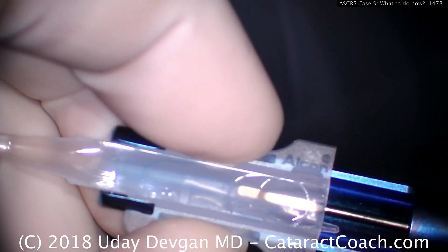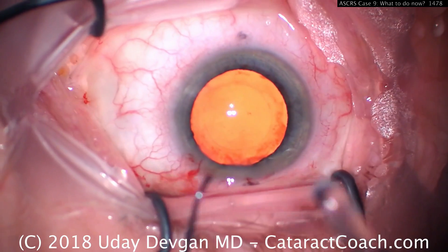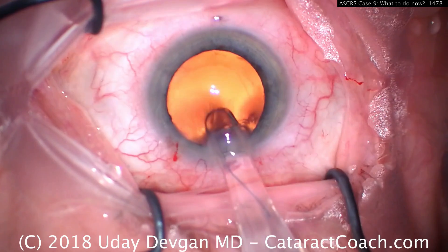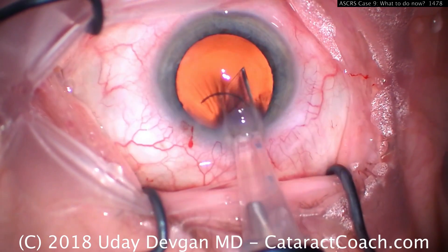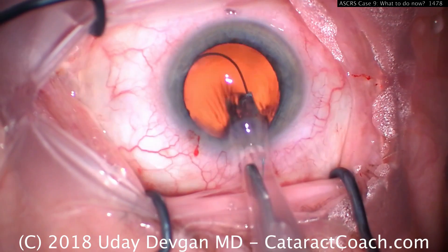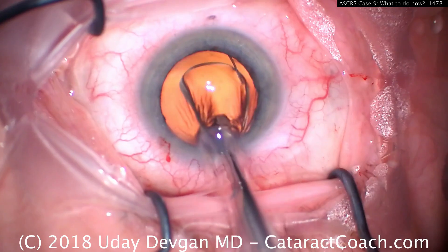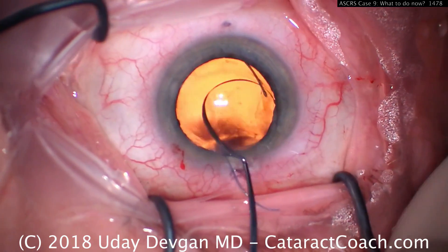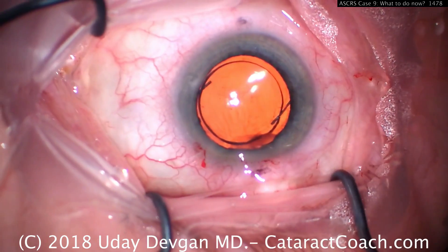Sometimes when you advance the lens down the cartridge, the haptic turns the other direction — you see that? Now it doesn't look like a number seven. So when putting this in the eye, as it comes out, stop and rotate to make sure the leading haptic still comes out like a number seven. Then rotate back the other way. You've followed the 7L rule — it required a little maneuvering, but you can ensure the lens goes in the eye in the correct orientation.